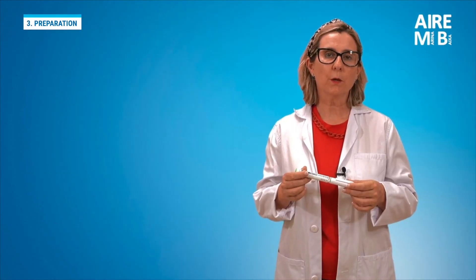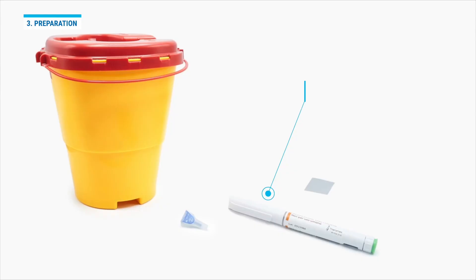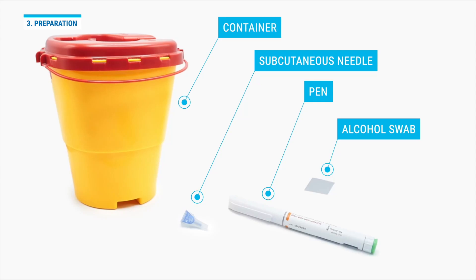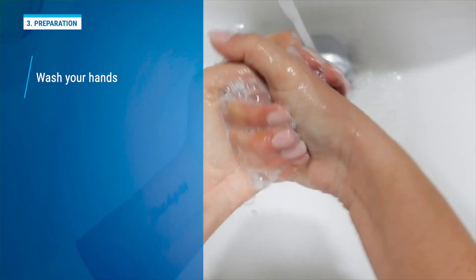We place the following items on a clean, flat surface: the pen, a subcutaneous needle, an alcohol-soaked gauze, and a container for needle disposal. Once everything is prepared, we wash our hands.